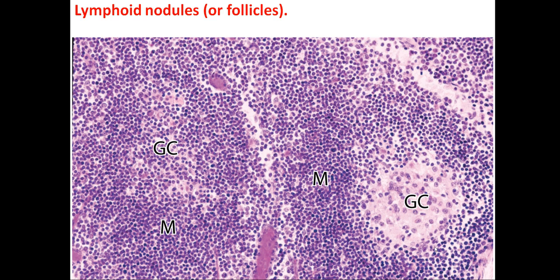It consists of two main parts: the outer or surrounding layer called the marginal zone, more bolded or darkly stained than the germinal center, according to the density of lymphocytes, mostly B lymphocytes. There are more lymphocytes here, so it is usually more bolded, more dark than the center.